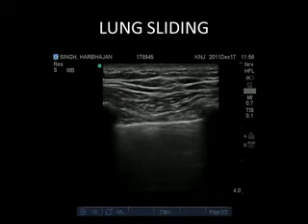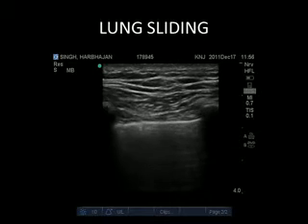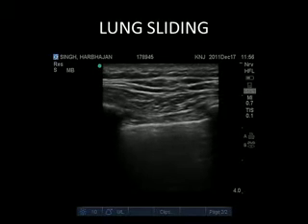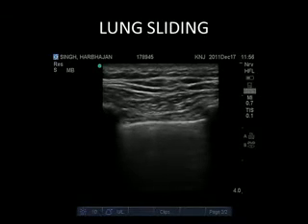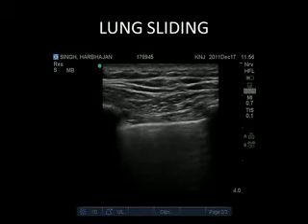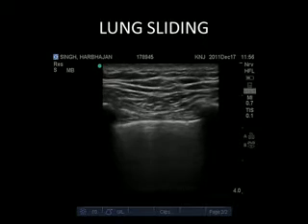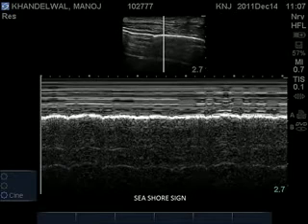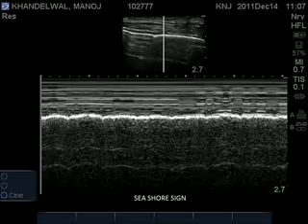The lung sliding sign indicates the sliding movement of the lung against the thoracic wall. On the ultrasound image, lung sliding is demonstrated as fleeting dots arising from the pleural line, moving in accordance with the patient's respiration. On M-mode sonography, lung movement produces the characteristic seashore sign. The lung sliding sign disappears in pneumothorax, complete atelectasis, and in apnea.